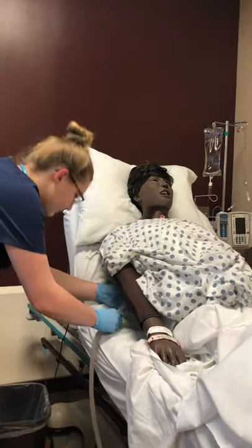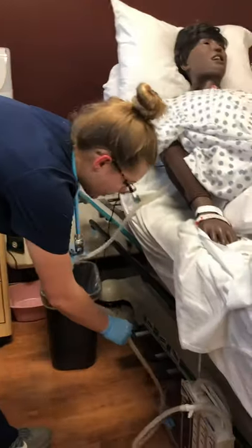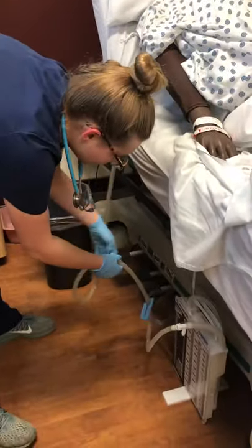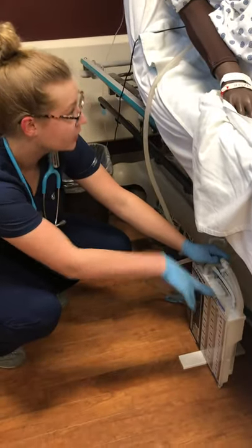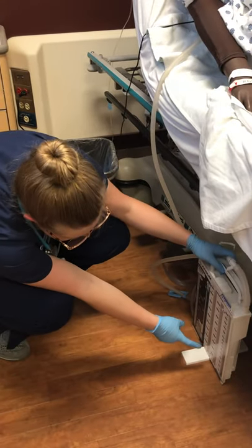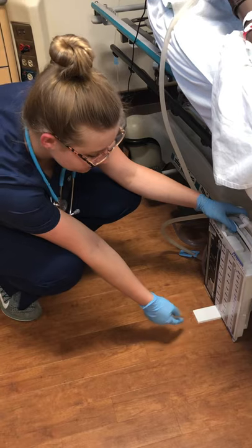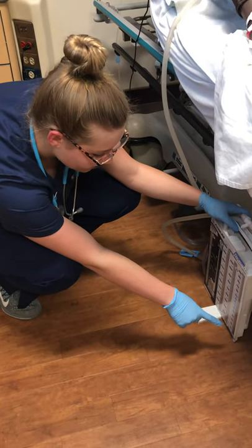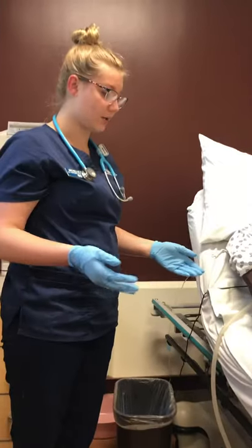I want to check and make sure all the connections on her tube are connected. We want to check the tube for patency. I'd want to come down here and make sure this box is below chest level, and I'd want to note if there's any drainage, the color of it, and any characteristics. I can also put my name on here and note what the time is and how much drainage there was.